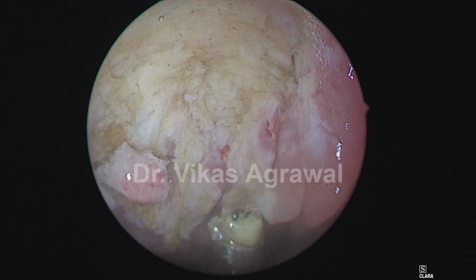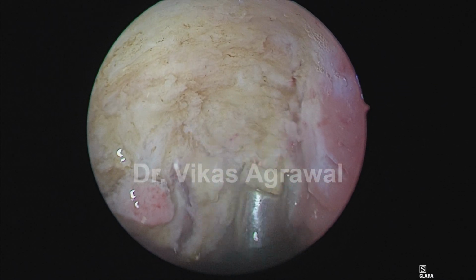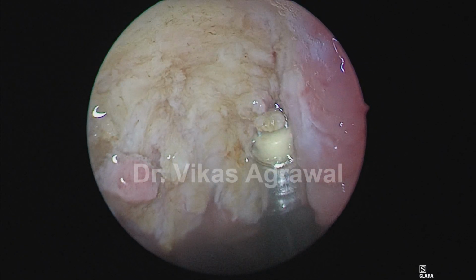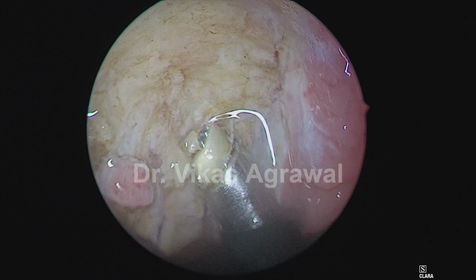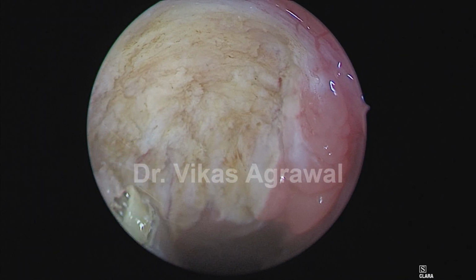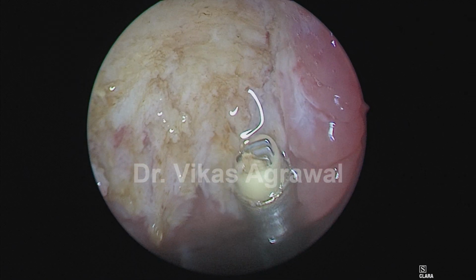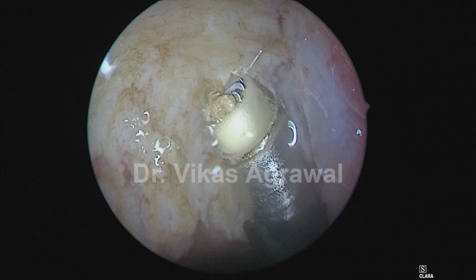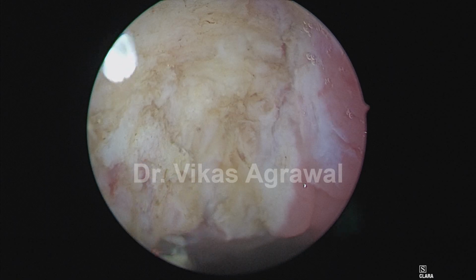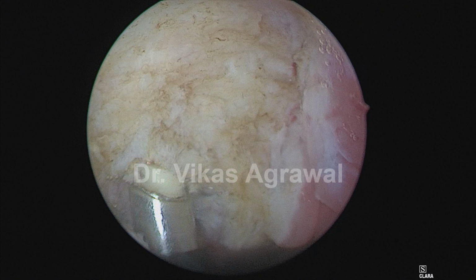So now my wand is a little blocked because of this soft tissue. You don't need to actually remove and clean it every time. If you keep on ablating, most of the soft tissue, as you can see, automatically gets ablated, and you don't need to take it out again and again. Now I'm going for the buccopharyngeal fascia in a moment.